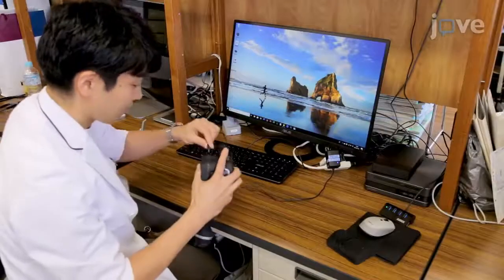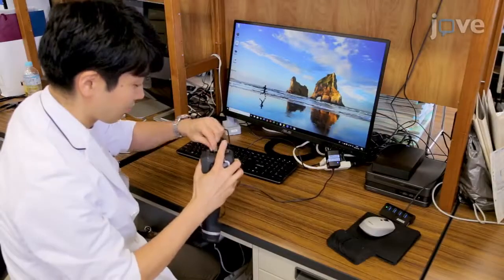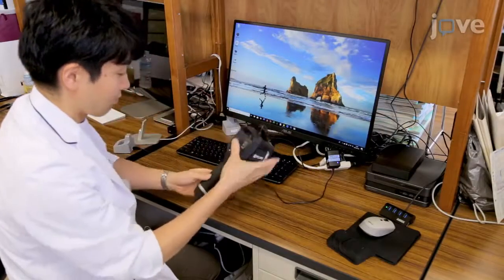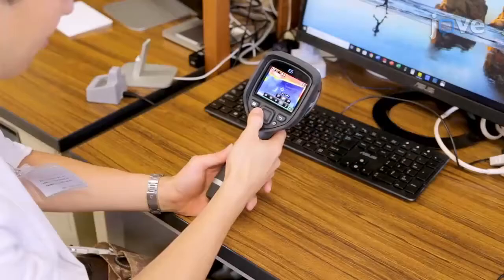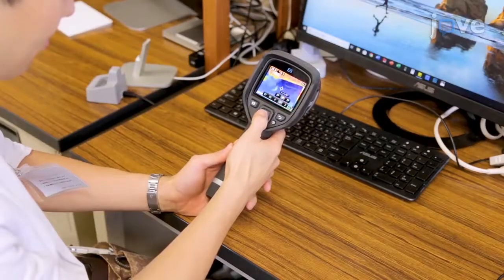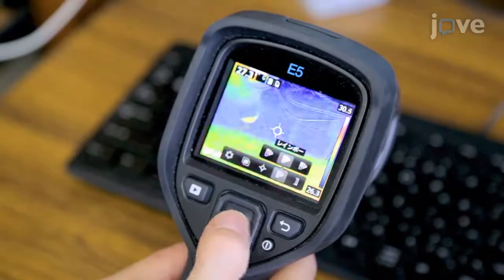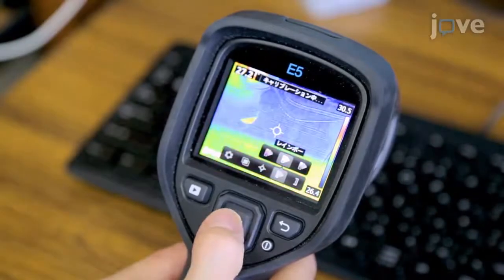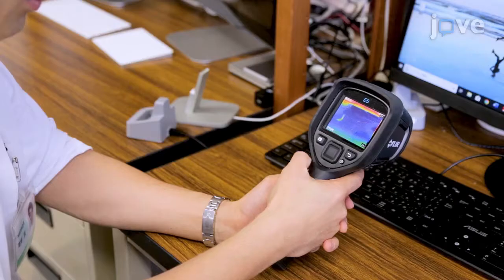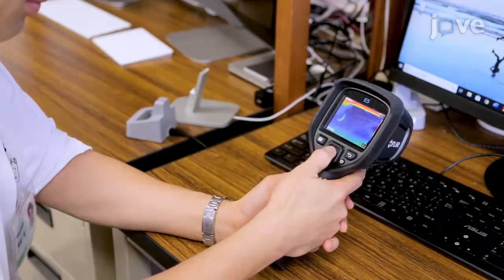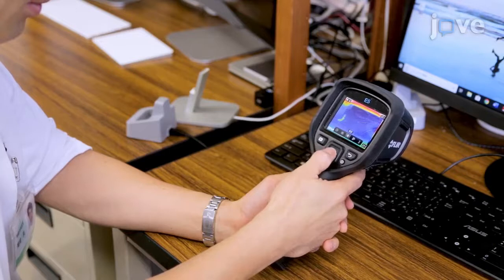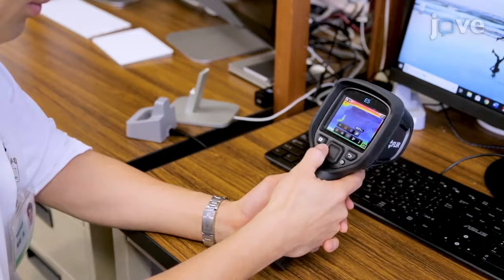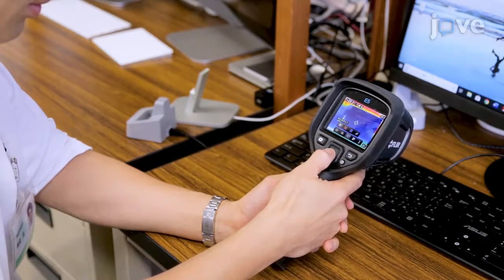Before beginning the measurements, charge and turn on the thermal camera. Press the center button on the camera to display the menu and select color in iron or rainbow. Then press the center button on the camera to display the menu again and select measurement in center spot measurement to allow measurement of the body surface temperature in real time.